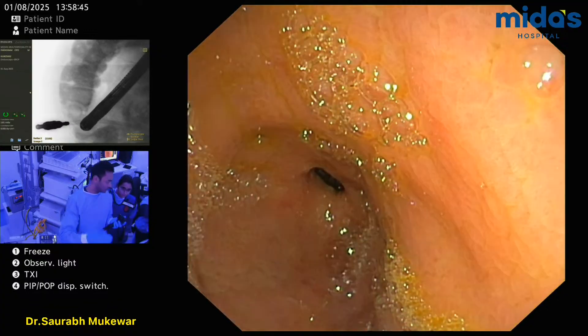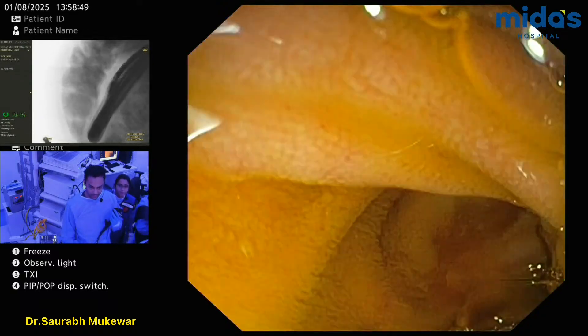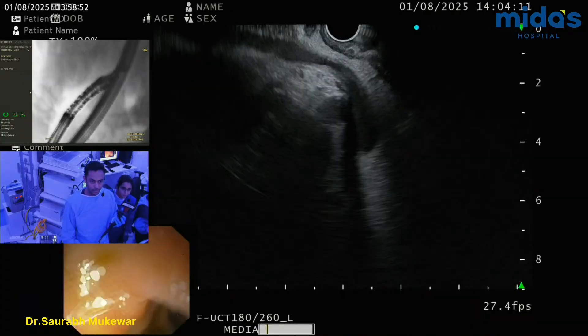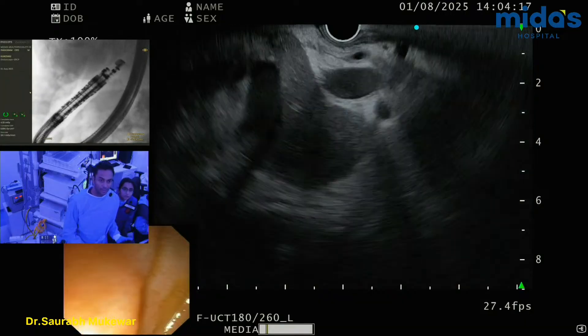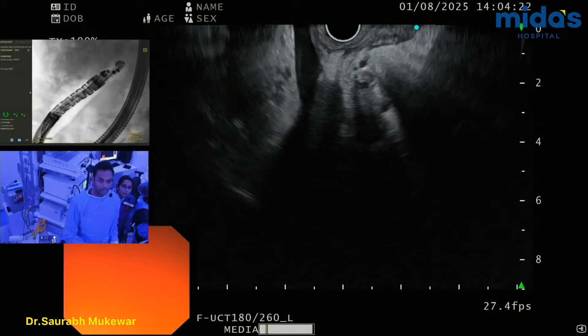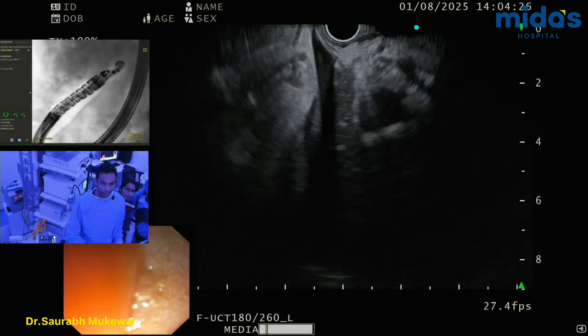Two places to do it. One is antrum and the second one is duodenal bulb. So let's see. Bulb is the location. And then I'm going to go and rotate the scope. So, you're looking at the pancreas — this is the head of pancreas. And then as we turn around, there's a cystic structure, and this is going to open into the gallbladder. But I'm not getting a great window right over here.